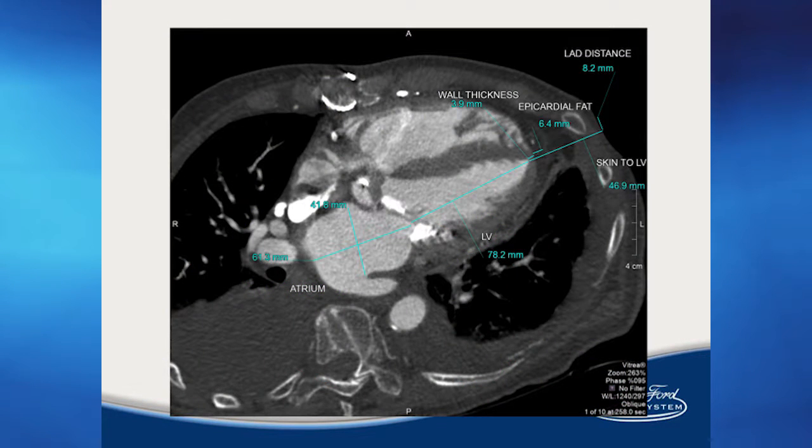And this is just another plan. Dr. Wang's preparing us in case we want to do an apical access. And what would that look like? Where are we relative to the rib? And how safe is it?